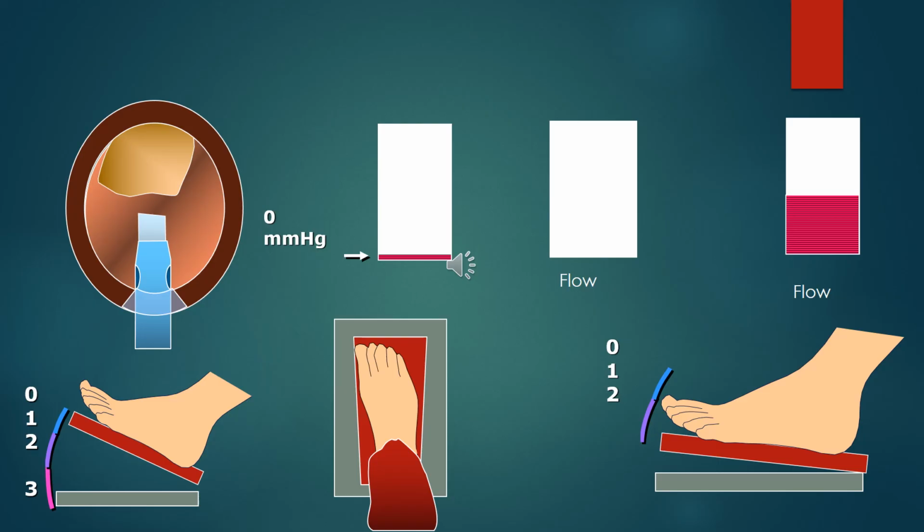You need to have the vacuum generated, and in a peristaltic pump, you can only generate vacuum when there is a block of the tip, that is occlusion. As the occlusion is happening, yet the pump is rotating, there's no flow, vacuum is generated inside the tip, inside the phaco tubing. As vacuum generates, you get a good hold of that nucleus piece on the tip. As you get a good hold, now you go down to foot position 3, and in foot position 3, you get the ultrasound power to hit the nucleus, break it into pieces.